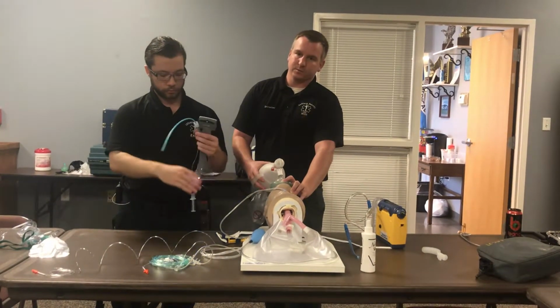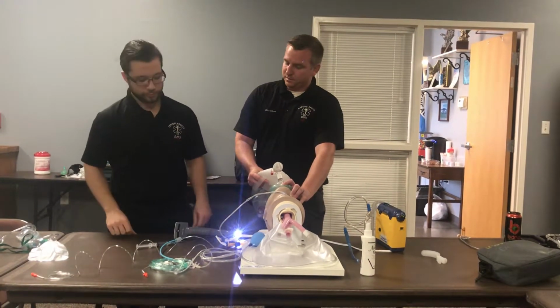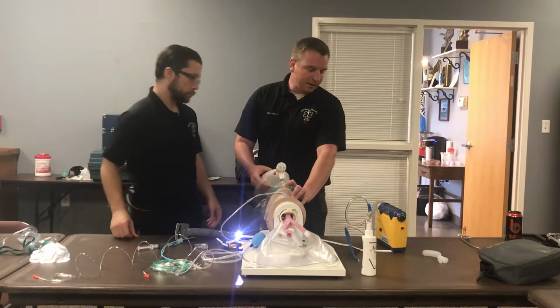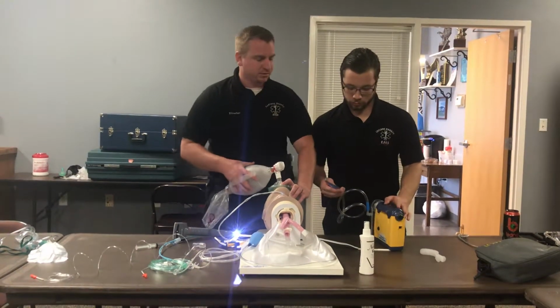Levi says, I have 100% intubation rate, and I aim to keep it that way. First time. Let's see. He's got his intubated end tidal close by, and he would never attempt intubation without his trusty suction.